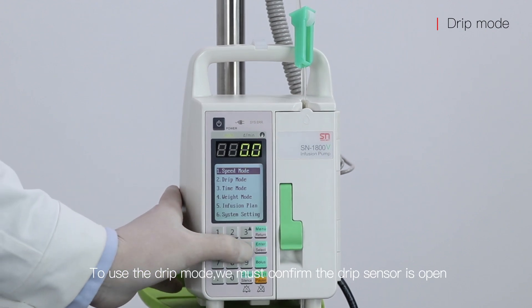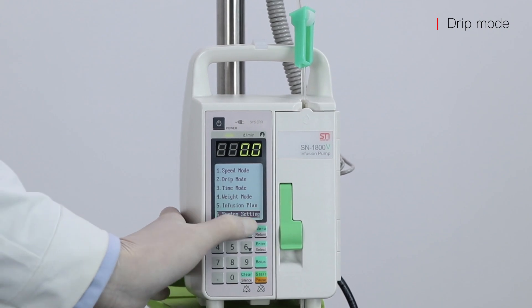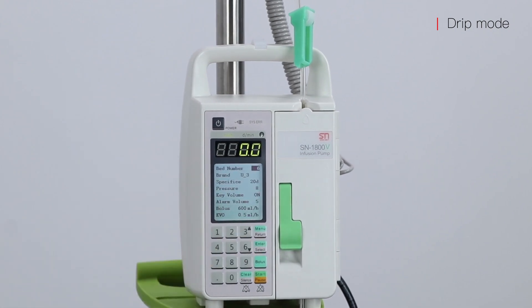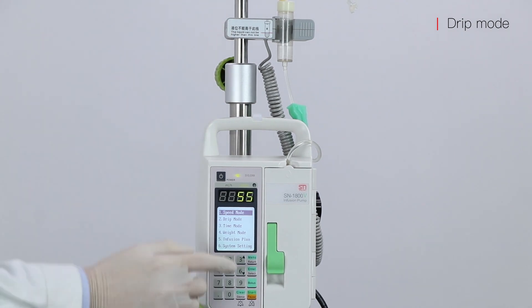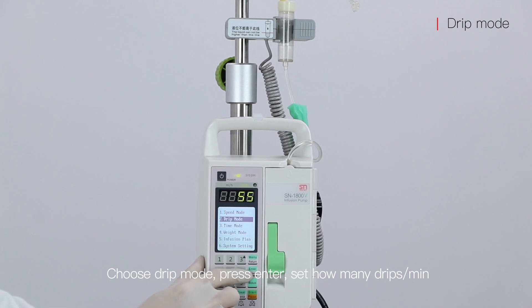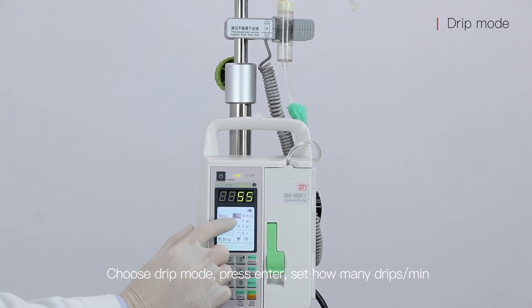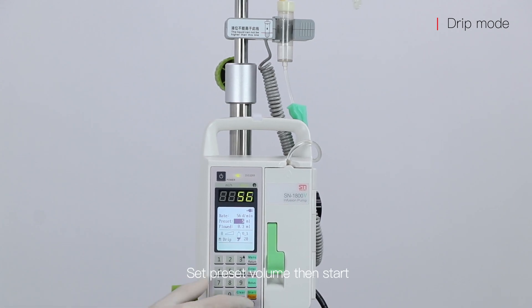To use the drip mode, first confirm the drip sensor is open, then check the drip sensor is connected. Choose drip mode, press enter, and set how many drips per minute. Set the preset volume, then press start.